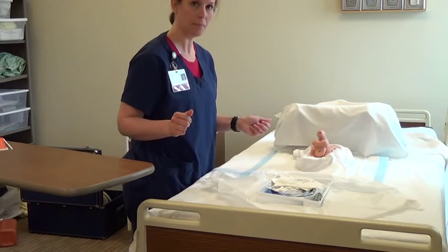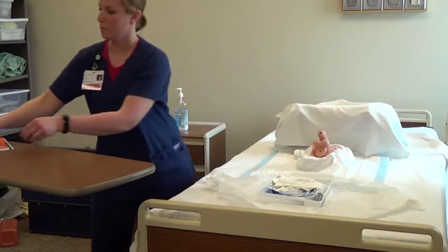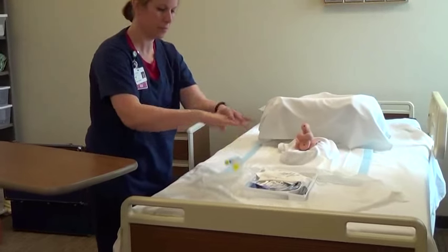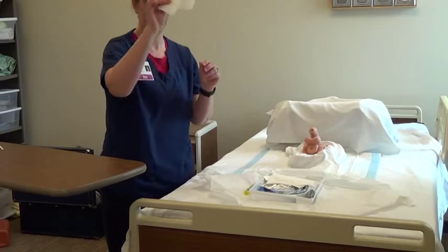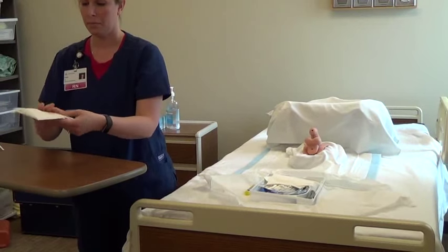For insertion in males, drop your Urijet onto your sterile field at this time. Don your sterile gloves in an area outside of the outer wrapping, such as on the bedside table.